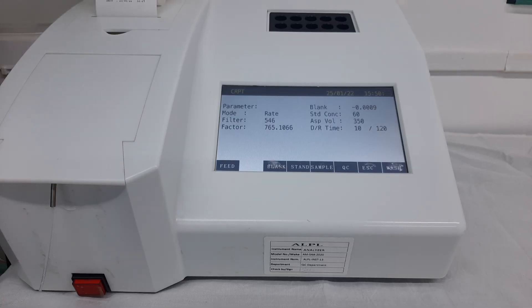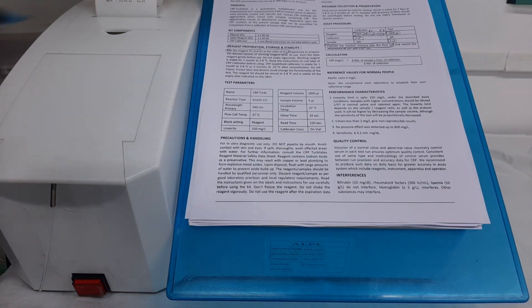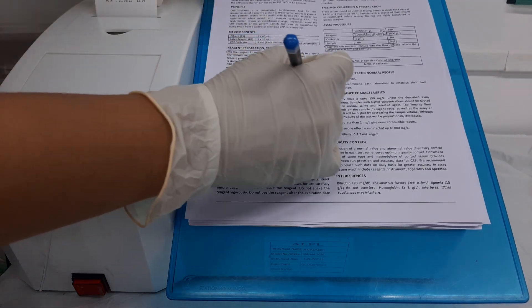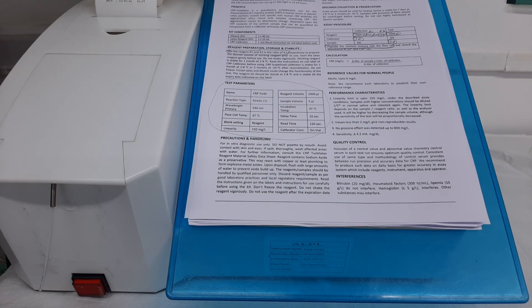Before adding the sample, make sure to open the program of CRP Turbolatex which you have previously saved into the software of the instrument. You may refer to a separate video in which we have explained how to use the test parameters mentioned in the instructions for use to program the software of the instrument.